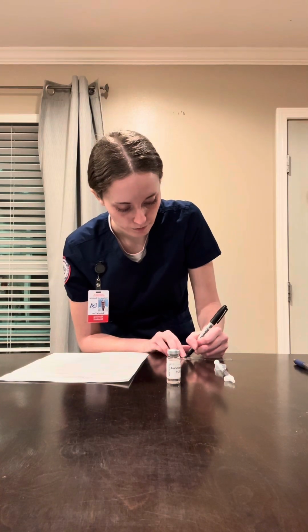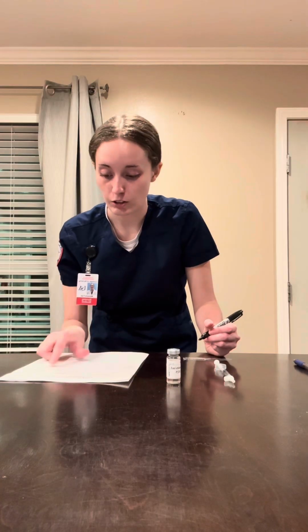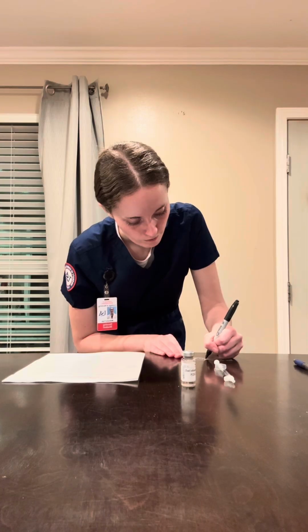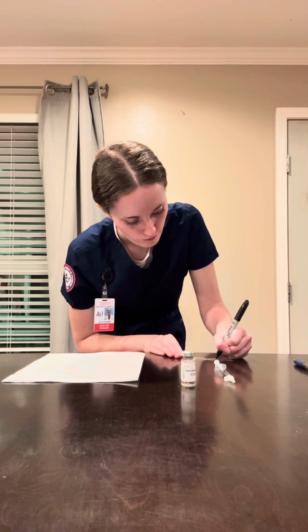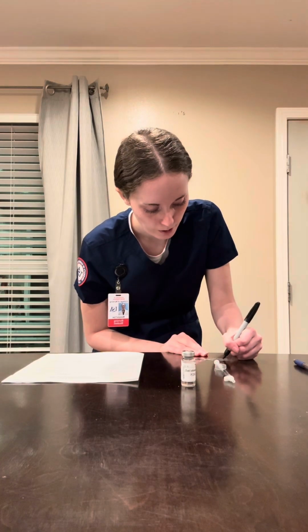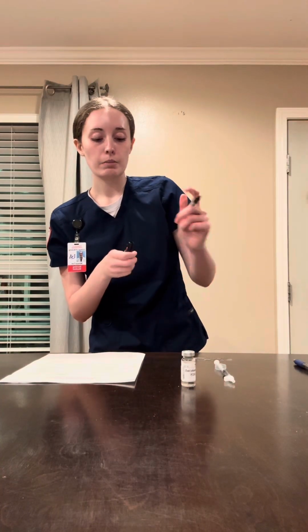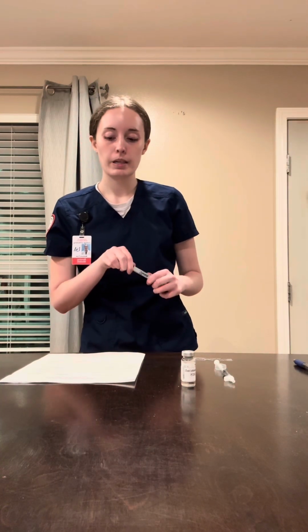So I have heparin, and I drew up heparin. Okay, so 5,000 units. This is 10,000 units per milliliter. So I would write 5,000 units per 0.5 milliliters. Okay, subcutaneously, sub-Q. Okay, every 12 hours. And the patient has not received it in the last 12 hours. Okay, so this is a high-risk medication, so I'd get a nurse to double-check everything behind me.